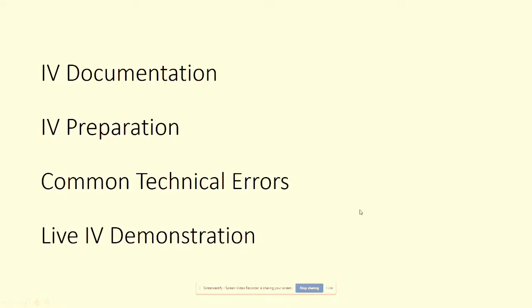Hello and welcome to your IV fundamentals training. We're going to be going over IV documentation, preparation, common technical errors, and we're going to do a live demonstration for you on a person.